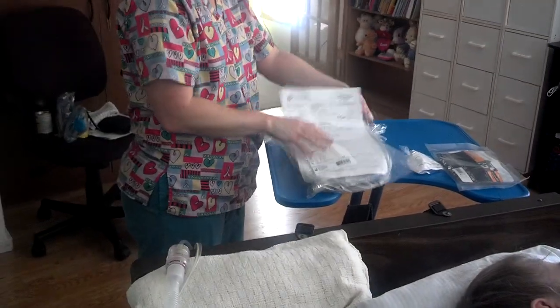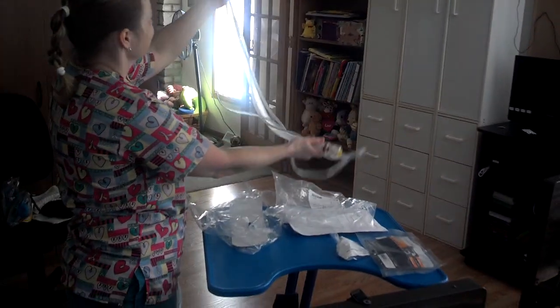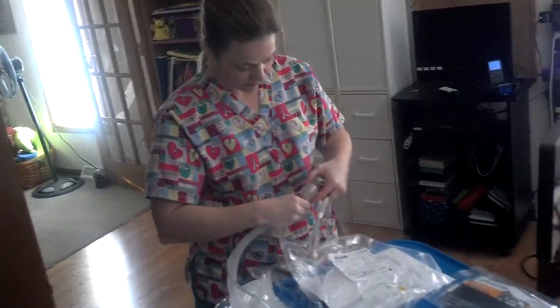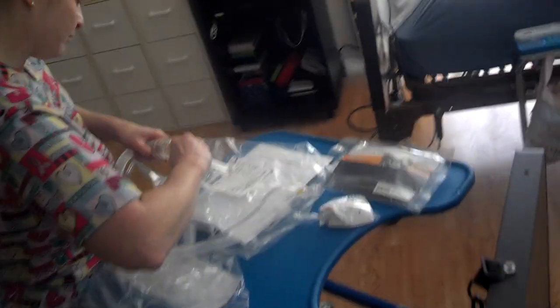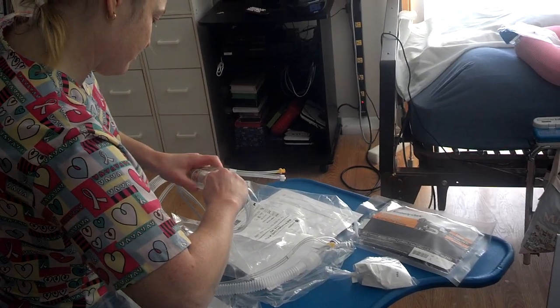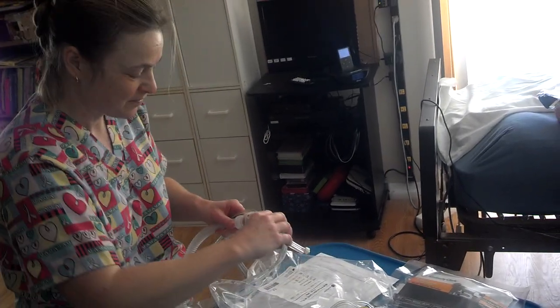There's the Y in her right hand, and there's the ventilator end in her left hand. I always try to set the PEEP first. Setting the PEEP valve — you push in and turn. There are numbers at the end of that. I can never see them so I'll show you the double check. I just turn it a few times until I think it's about right and then double check with the machine.